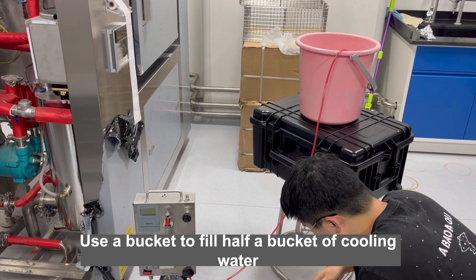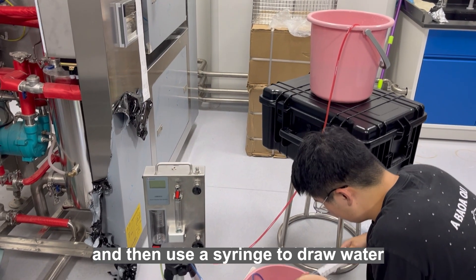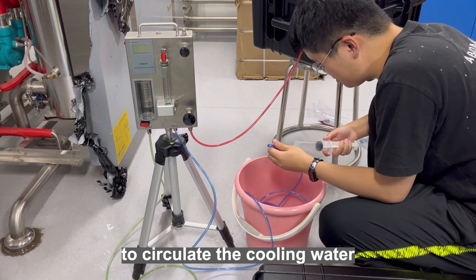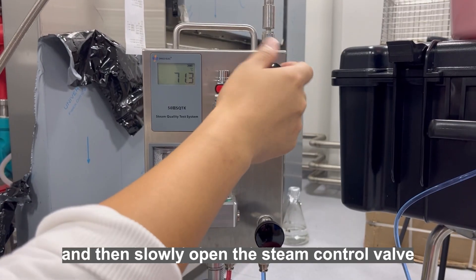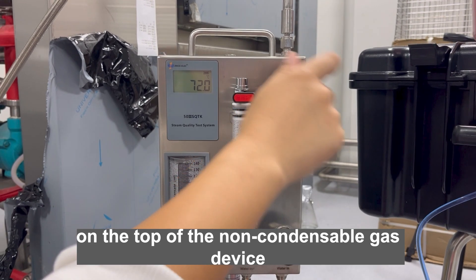Use a bucket to fill half a bucket of cooling water. Place the bucket higher than the top of the non-condensable gas device to form a pressure difference, and then use a syringe to draw water from the cooling water outlet pipe to circulate the cooling water. After the cooling water circulates, open the steam pipe valve, and then slowly open the steam control valve on the top of the non-condensable gas device.